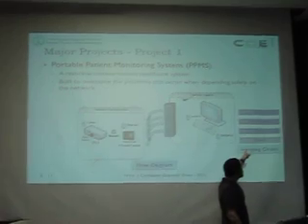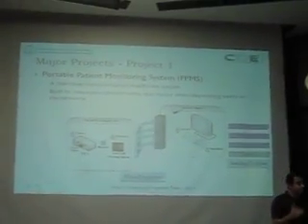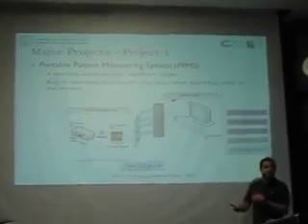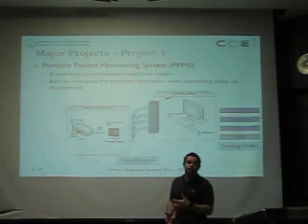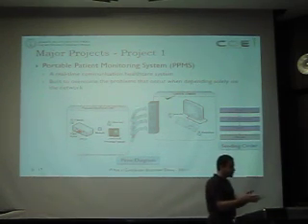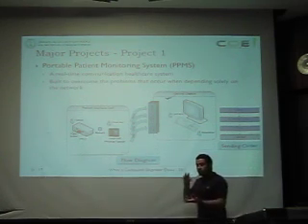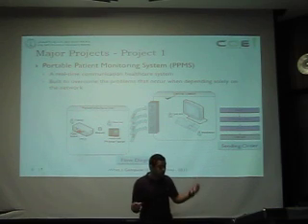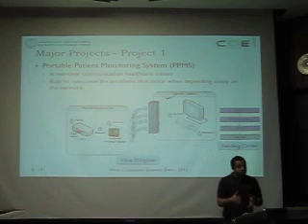Of course, there is a sending order. If the first one, for example, fails, then we will move to the second communication standard without losing any data. We just want to continue our communication between the 2 entities of the project, which are the patient interface unit that sends the monitoring status of each patient to a central station. The central station is the second entity of the project, or the second part.